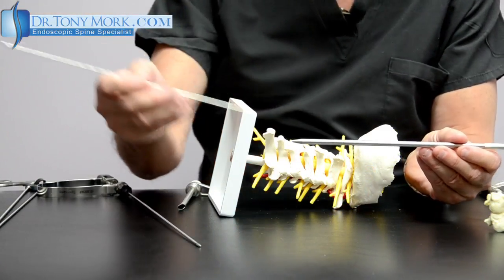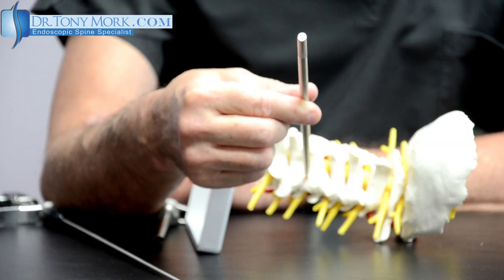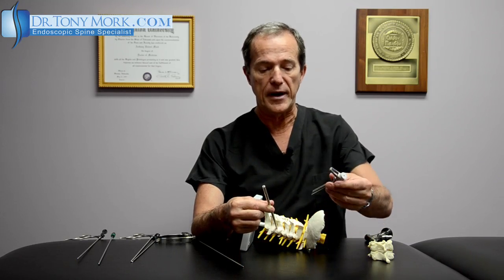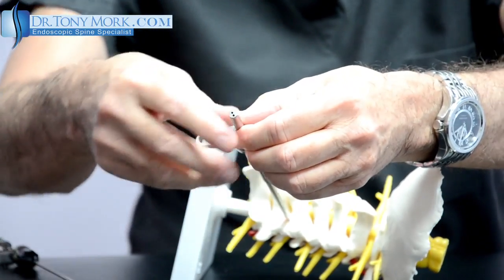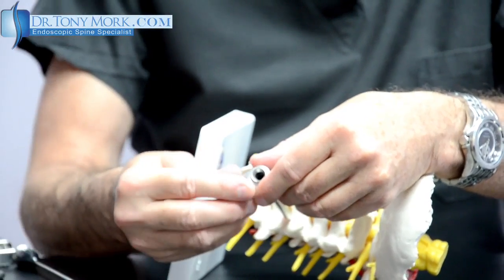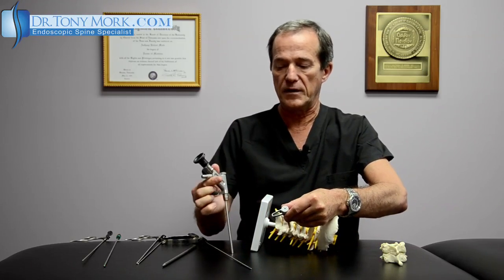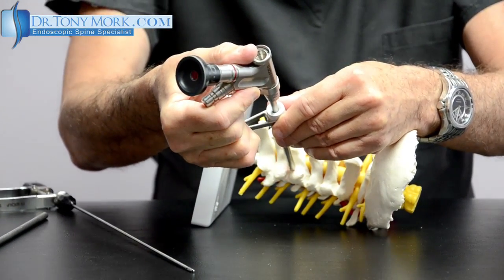This is the size of the cannula — between three and four millimeters — and through a very small incision this is passed over the guide wire. Once passed over the guide wire, I have a small obturator that goes down to the facet or the level of interest. This establishes the initial port through the soft tissues down to the area of interest, and it is followed by a cannula which goes over the obturator down to the area of interest. Then the initial obturator can be removed and a little rubber seal placed.